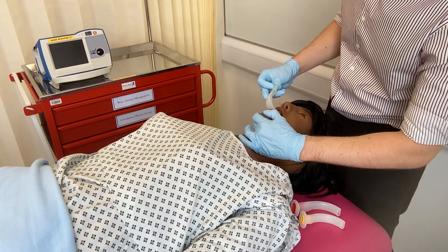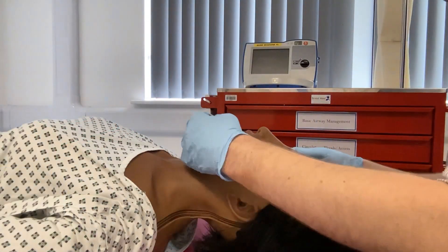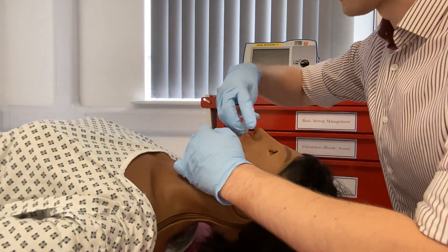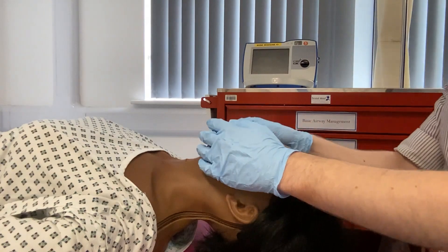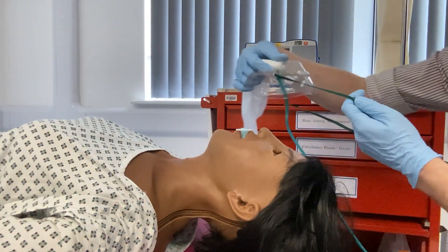The device is inserted upside down and run along the hard palate. Once around halfway in, rotate the device and finish insertion. Once secure, apply high flow oxygen.